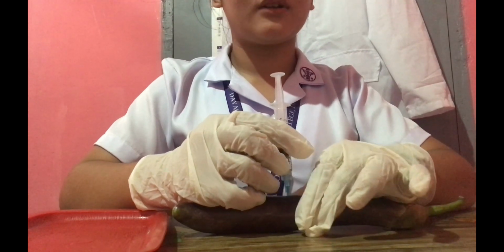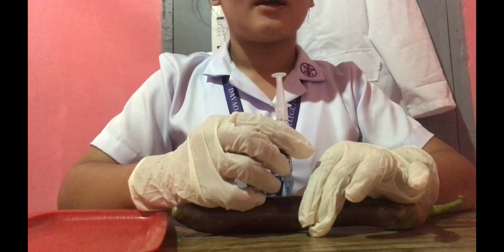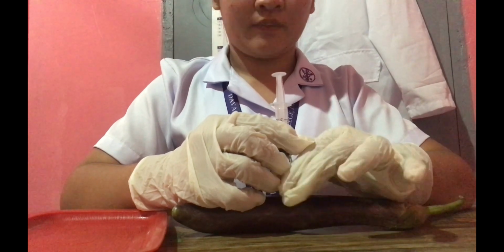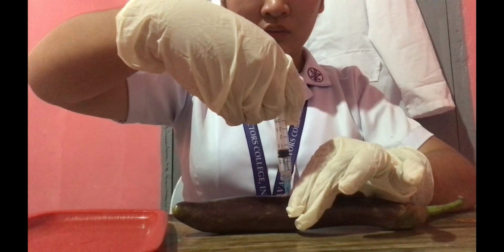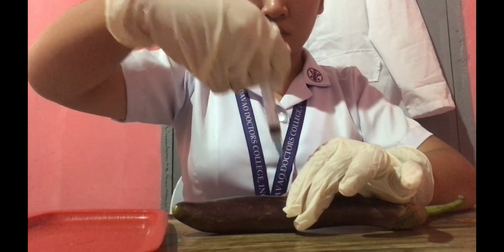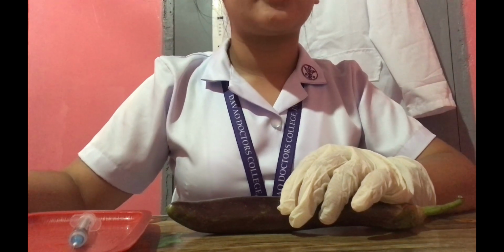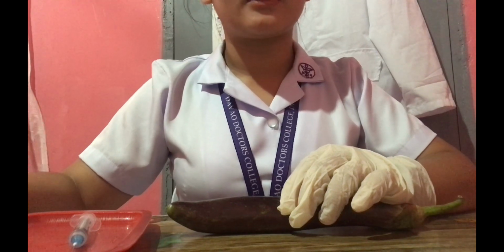Then hold the barrel of the syringe steady with your non-dominant hand and aspirate by pulling back on the plunger with your dominant hand. Okay. So if blood appears, withdraw the needle, discard the syringe, and prepare a new injection. If blood does not appear, inject the medication steadily and slowly.